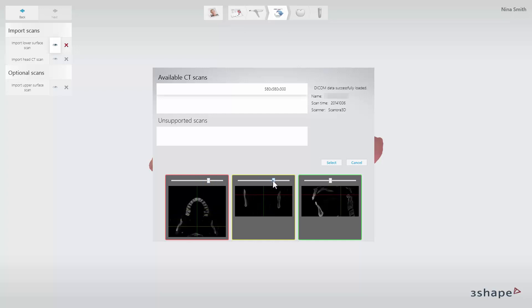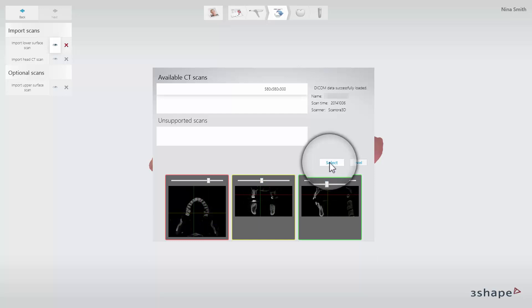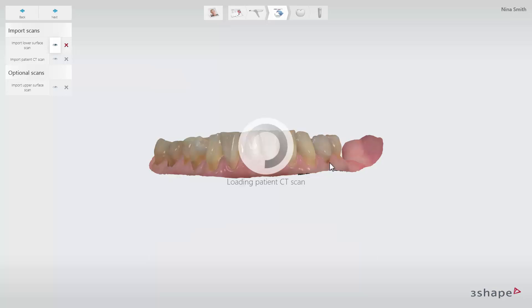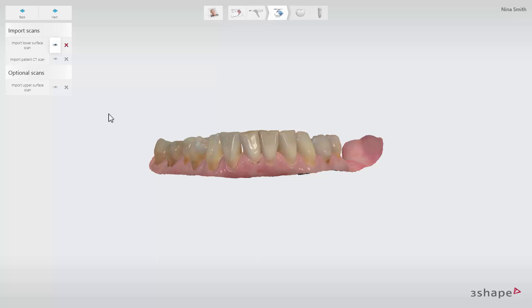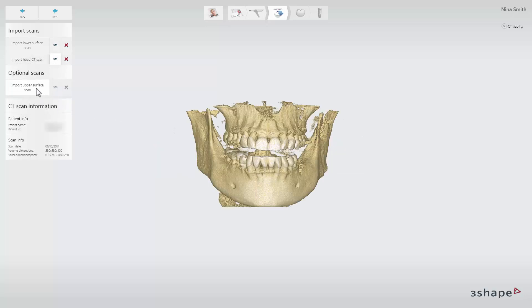Review the Head CT Scan by using the sliders and click Select to confirm that this is the scan you want to work with. It is optional to import the antagonist scan. Once the scans are imported, you will move directly to the Anatomy Design step by clicking Next.